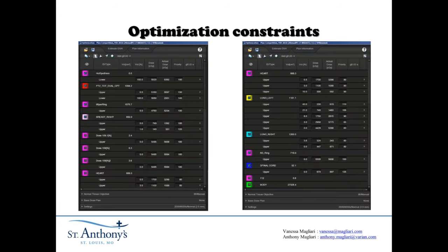Here is a screenshot of all the constraints we used for this plan competition. We didn't start with these constraints — this is really our end result. You can see there's not a whole lot of magic in these constraints. We came up with some normal good constraints and a couple of dose-specific structures to try to control the hot spot. Every time we'd automatically contour the dose at a certain level, we would delete where it overlapped with the hot spot, because that's the contour we were actually asking it to dose there. The hottest spot on some original optimizations ended up on top of the GTV, so we said we want to keep this one here and remove all the rest so we can get our hot spot inside the GTV — which is not usually something I see in most protocols, but it's a good trick for plan competitions.